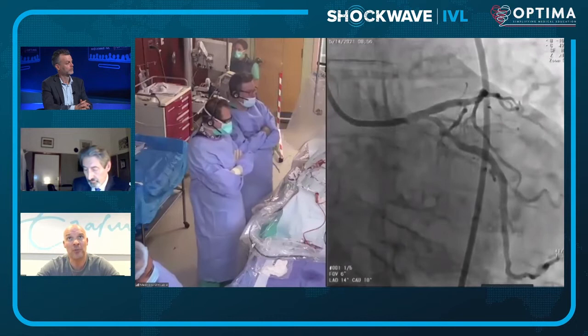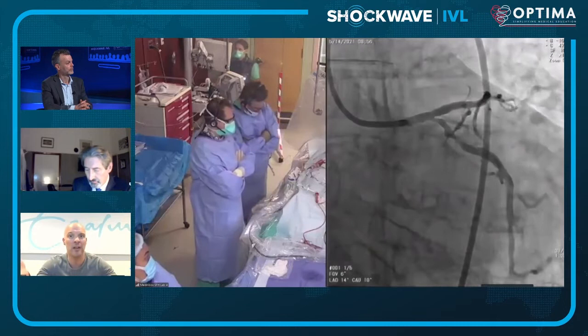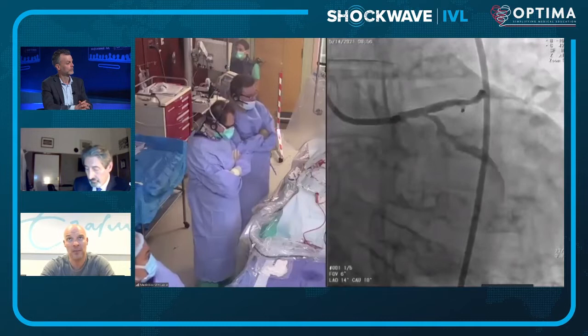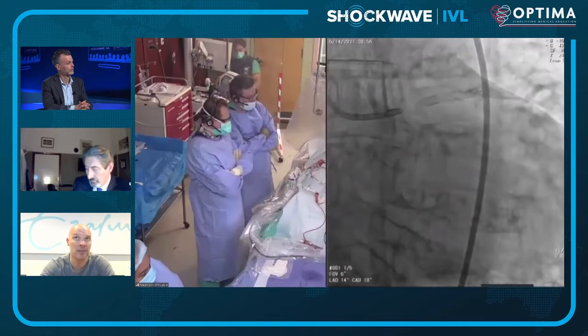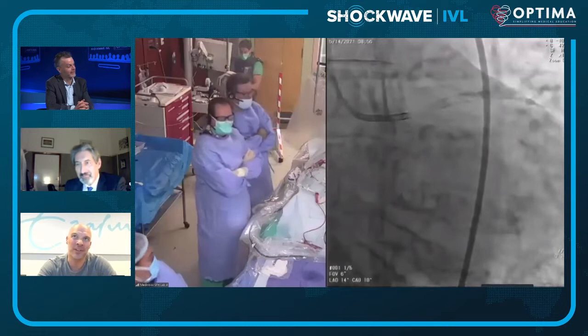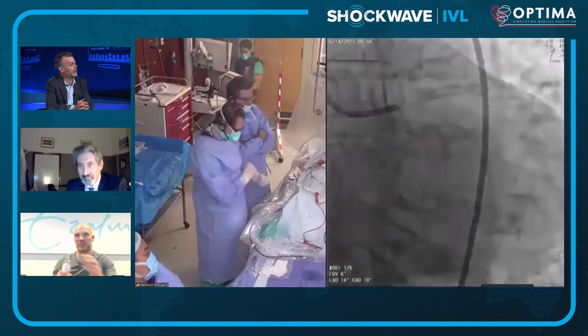Nicholas: With OCT imaging you might be able to get away with lithotripsy and be done in 20-30 minutes depending on the findings, but he would restrict himself to the first 20 millimeters. James: Let's see the OCT and develop the discussion from there — we can't argue with imaging-first given what we've heard. Before going live, Alan comments on physiology: rather than just determining if a lesion is significant, he finds a pullback resting index — here using iFR — very helpful to see where the step-up is and plan the procedure accordingly.